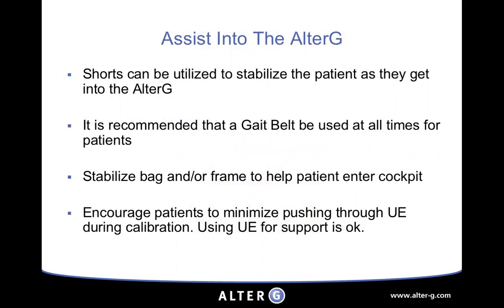To get someone into the Alter-G, have them put on the shorts first. I always recommend a gait belt because you don't want to tug on the shorts too much, and after they're zipped into the bag you won't have anything to hold on to. You can stabilize the bag or frame to help the patient enter. Once inside the cockpit, remind them to stand straight — not to sit down in the shorts — because when they sit, their center of gravity moves outside their base of support and the treadmill belt can move. Keep the patient standing with their center of gravity over their base of support.